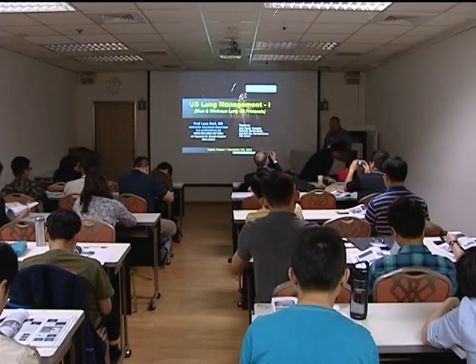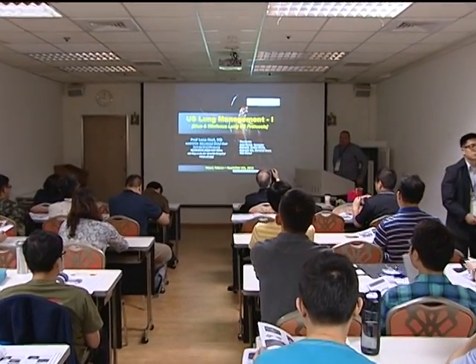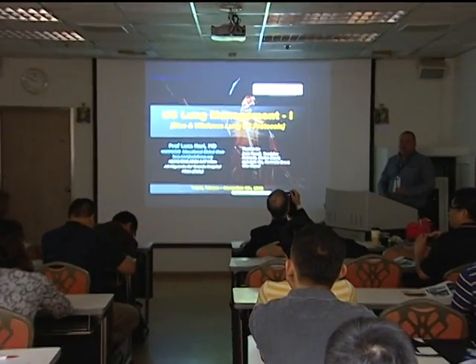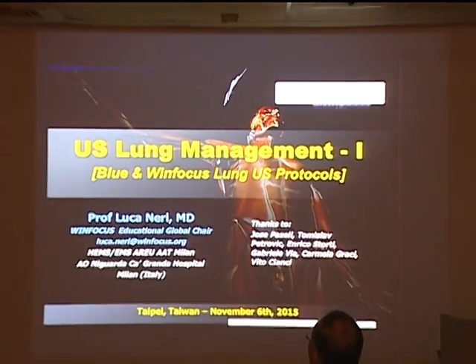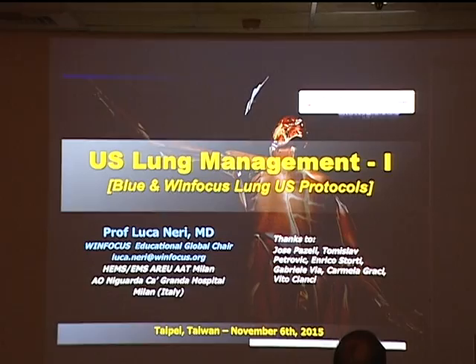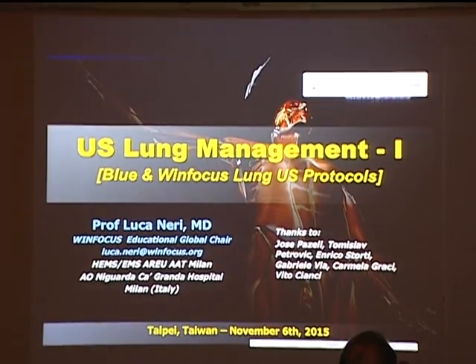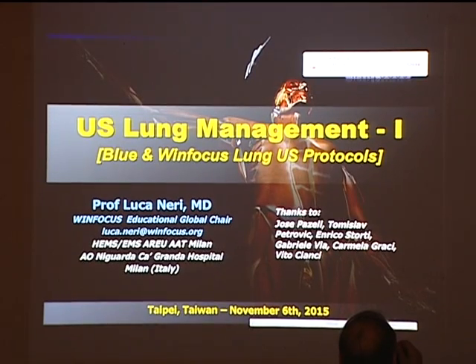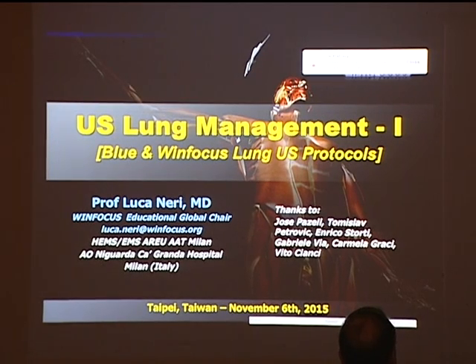Okay, so let's continue to overview the ABCD applications. After A, the enhanced management of airway with point-of-care ultrasound, let's now start overviewing the overall breathing, respiratory management enhanced by ultrasound.